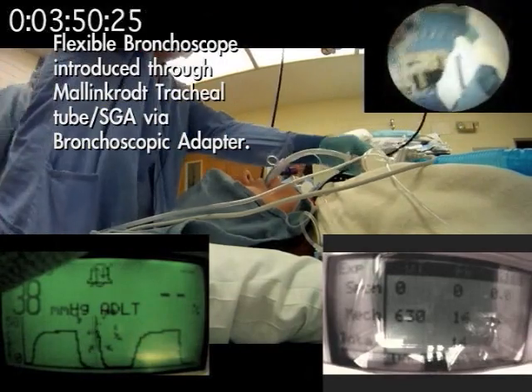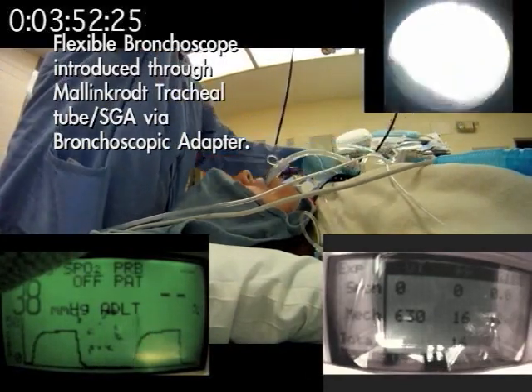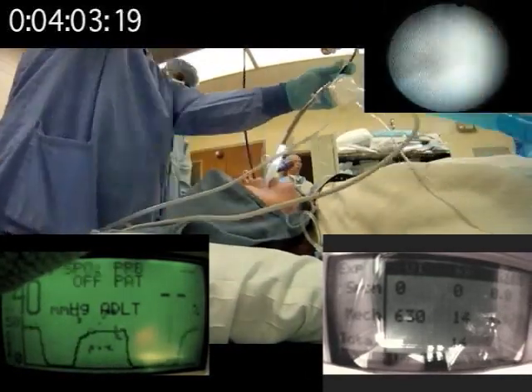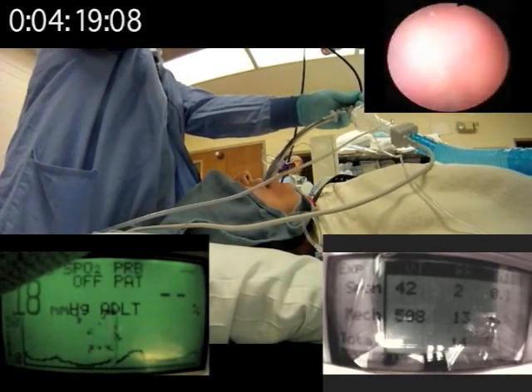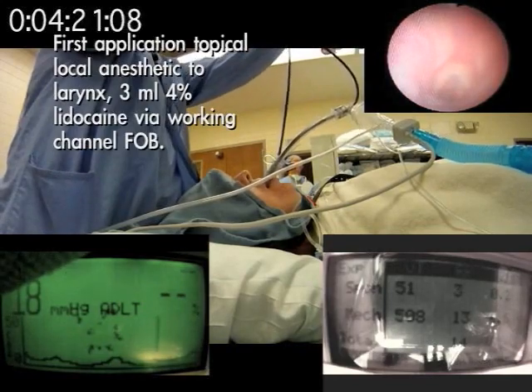I'm going to go right down the elbow. There's our larynx right in front of us. Do you see it? Yeah. Okay, let's put some local on it. Count three — one, two, three.